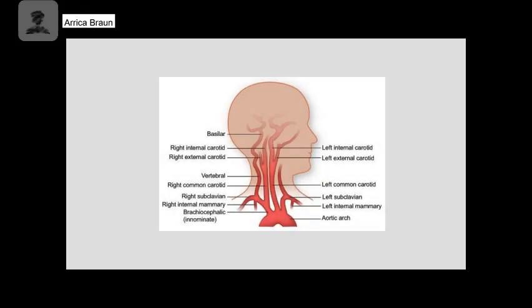So here's that example on the diagram. Your aortic arch is down here. We would place a bolus tracking software there. Once it hits that certain Hounsfield unit, we would then watch as it continues up into the brain. We would find the circle of Willis in here, and we would then decide, is there something going on from there.